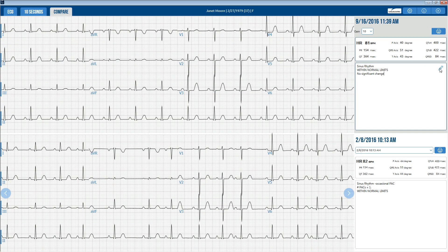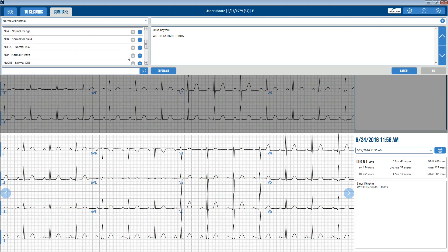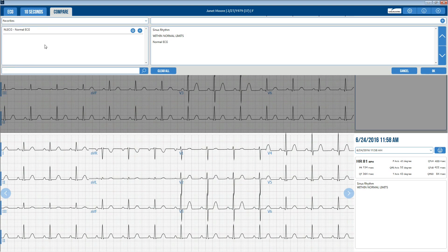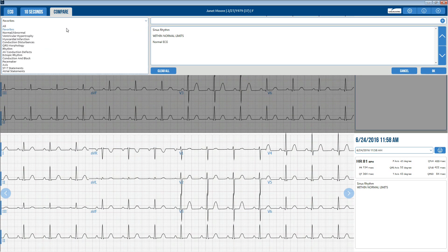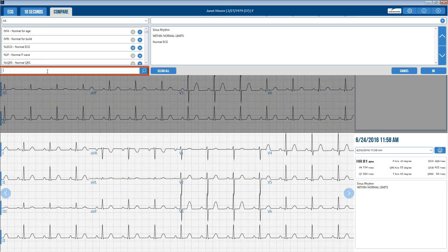Once in the interpretation edit screen, you may click on the top-left drop-down arrow for the appropriate category, and then click the Add button to add the desired location. The selected interpretation will be displayed in the right window. Click the Favor button to add frequently used interpretations to the favorites list. You can also use the search field to search through all of the preset interpretations configured from list management.